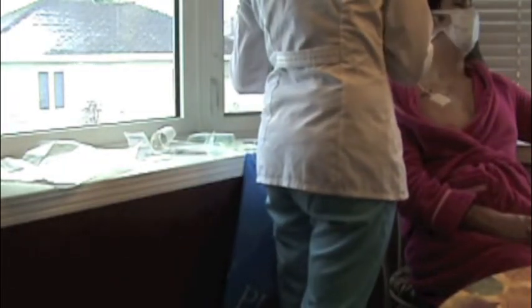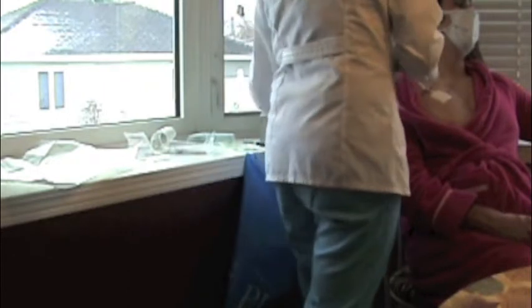All right, everything is intact. The lines are going back. I'm going to tape those back so that they're not flopping around. In fact, I think I'm going to use my soft tape because it is more comfortable for the patient than that medical tape. We don't want these flopping around, so I'm just going to tape them back right up here. So the tape is more gentle on the skin than the other.